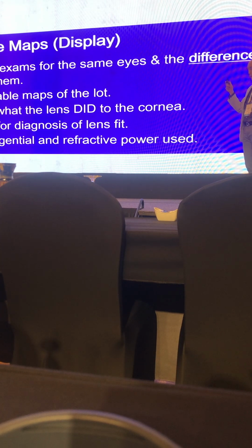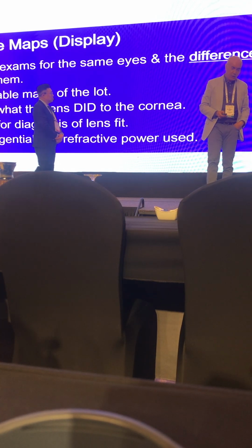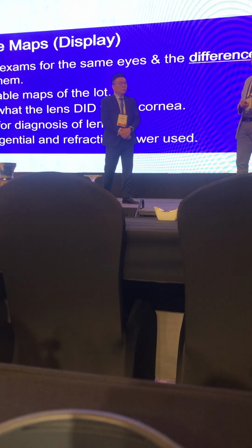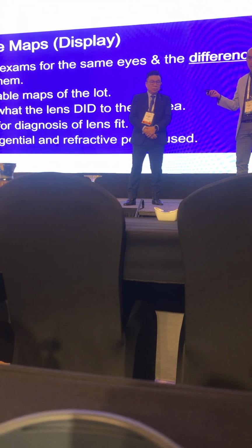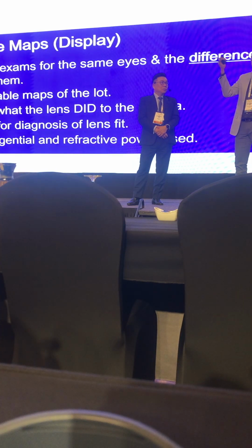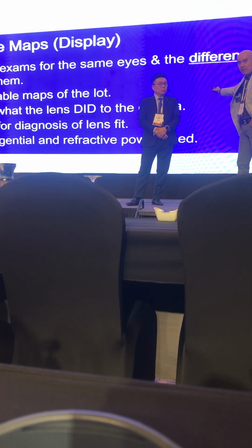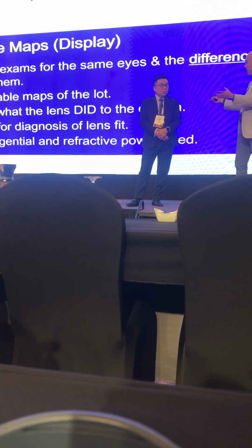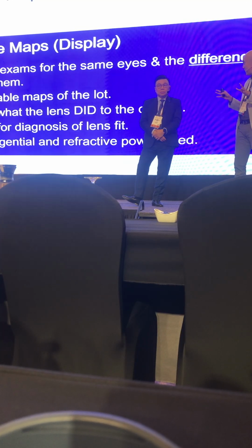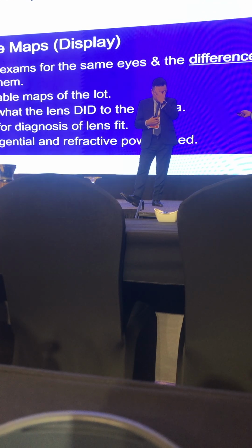Difference map, that's also very important. You know why it's important? Because in Malaysia, sometimes new beginners ask me to solve their problem. And I say, fine, you send the axial map, tangential map and difference map. If you don't send me the difference map, I'm not able to solve it professionally. Sometimes I give you wrong advice. So the difference map is very, very important.